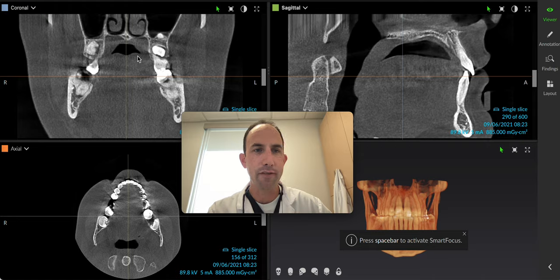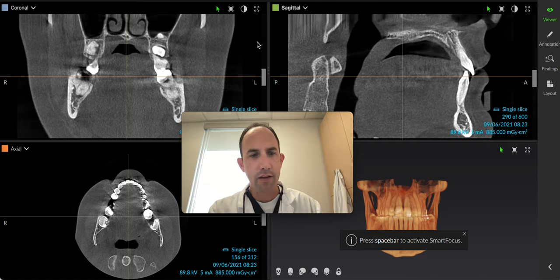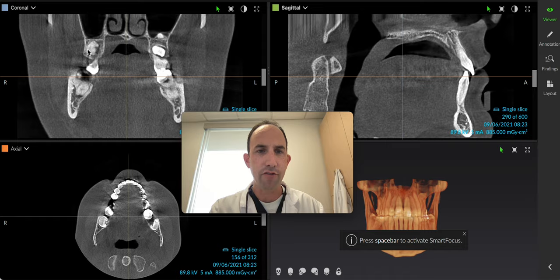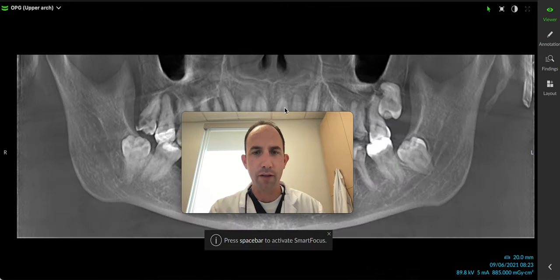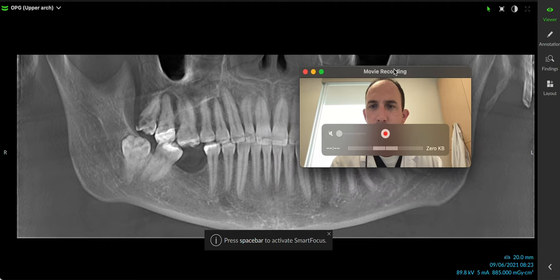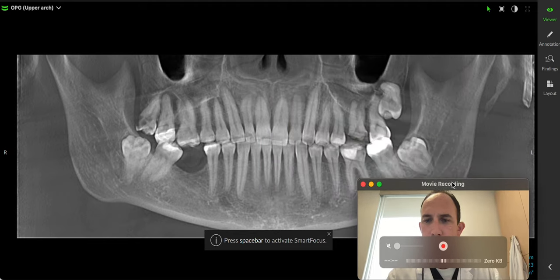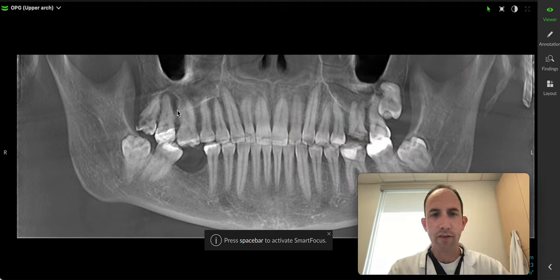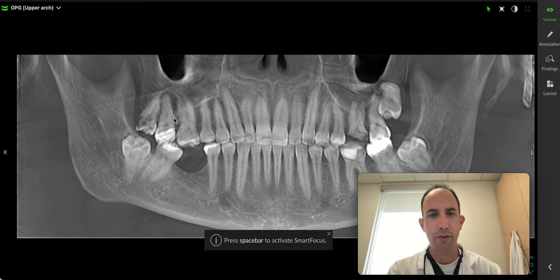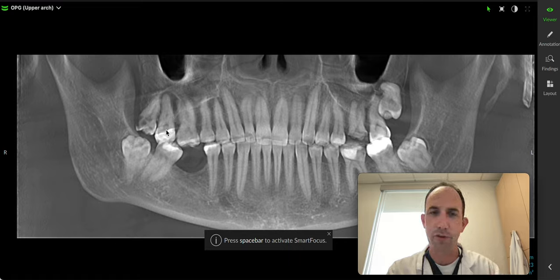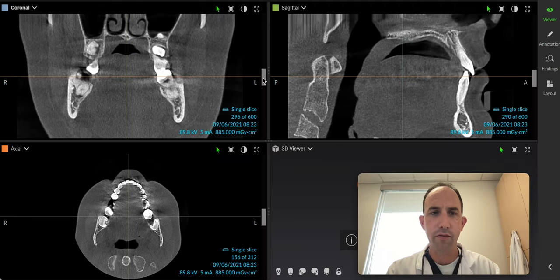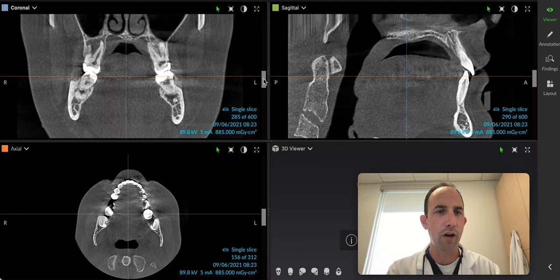Here's our patient. You don't really get a hint of anything going on. She's got some obviously impacted wisdom teeth. Here's her panoramic. There's an abscess there. So we think tooth number two has an abscess and we're going to need some treatment on tooth number two. Well, if you go to the actual 3D and scroll through this, you can see how monstrous this abscess is on tooth number two.